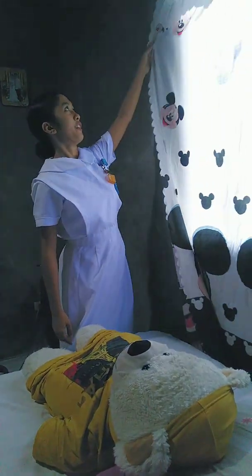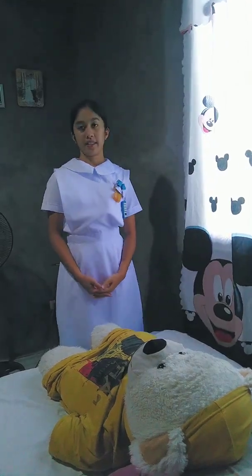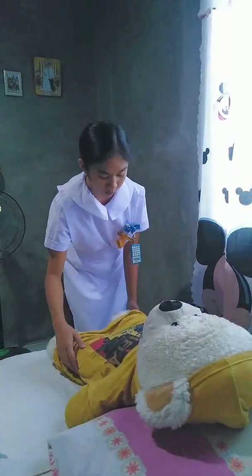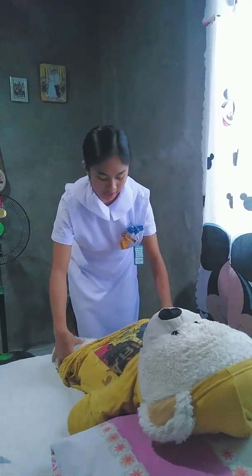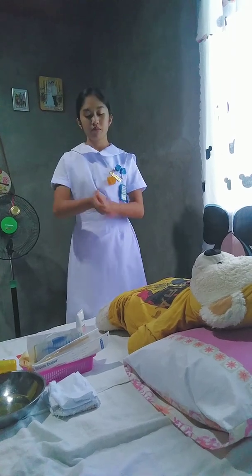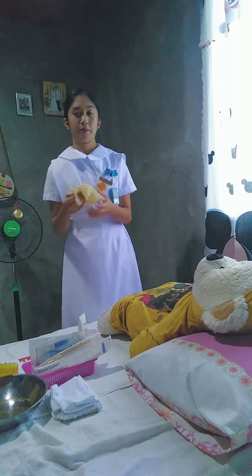Okay, that's great. So let's close the curtain for the patient's privacy, close the door, and secure good lighting for the accuracy of insertion. Position the patient correctly. Assist the patient to a recumbent position with the knees bent and the feet flat on the floor. Next is to perform hand hygiene to avoid contamination, and then put on the gloves to clean the perineal area.